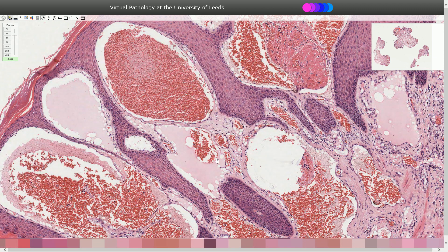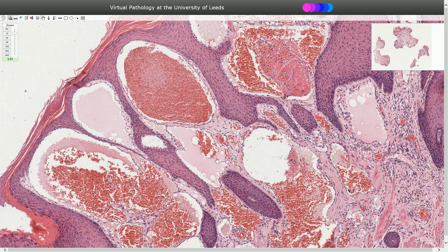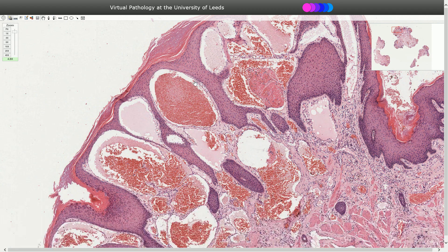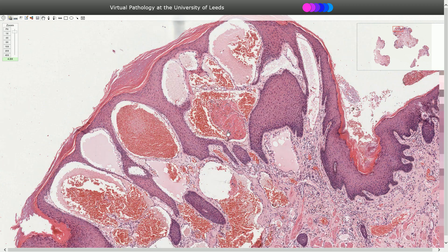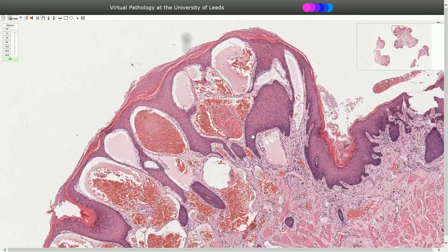We can also see reactive epidermal changes characterized by acanthosis, hyperkeratosis, and elongation of rete ridges around the ectatic blood vessels — so-called collarette — and that is also quite characteristic for angiokeratoma.